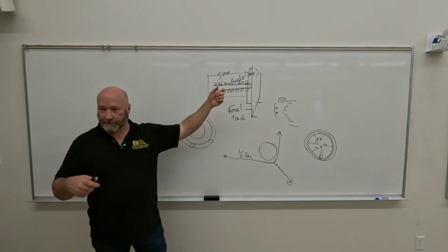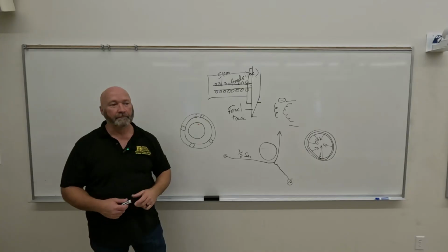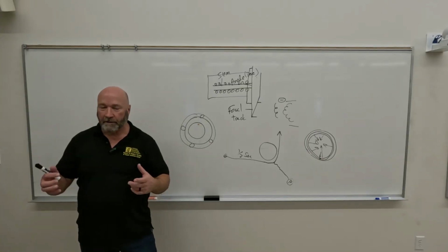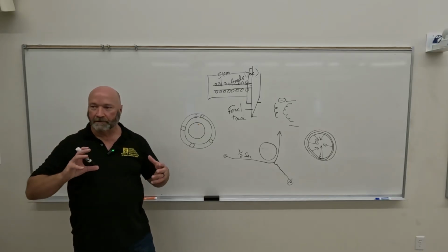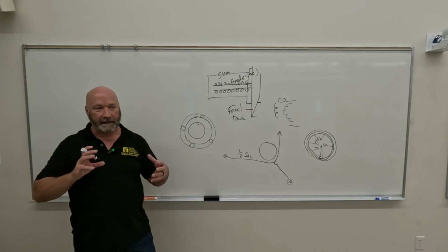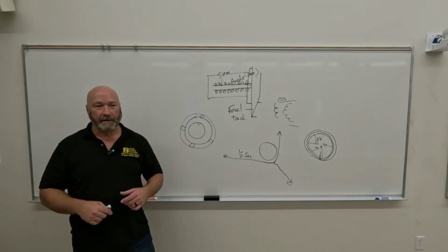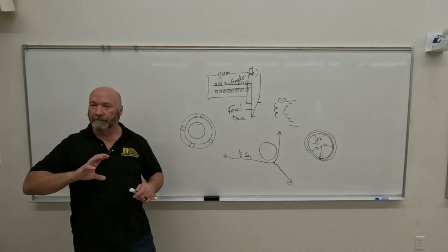Do you hear your rotors still rotating? For a short time, right? So y'all noticed whenever I passed the tube around and you rotated the tube, what did you notice about the anode as you rotated the tube? It's like fixed. It's insanely balanced, right? So you rotate it and it doesn't move all that much.